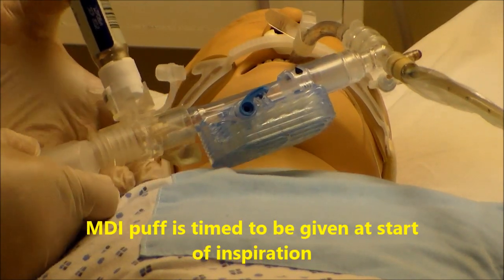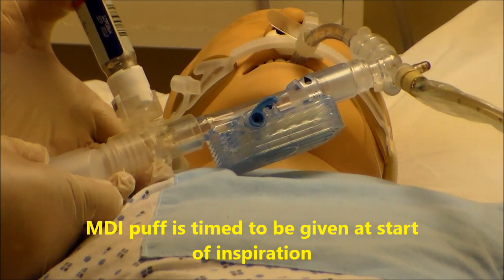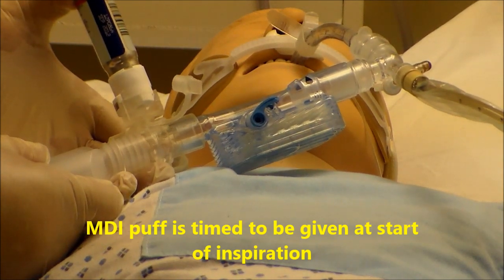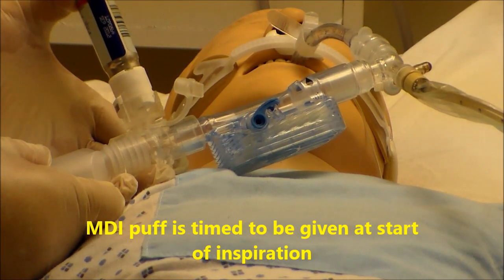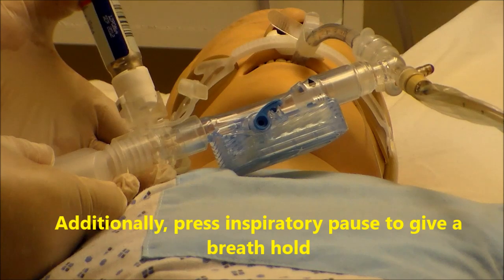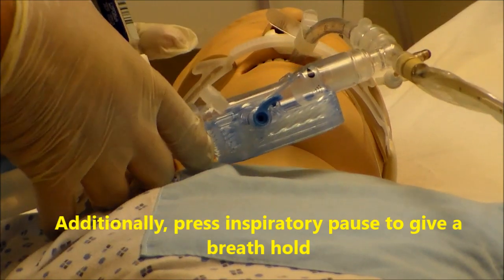Then you want to time it on inspiration. So when the patient begins to take a breath, you want to push down and also hold an inspiratory hold to create a breath hold.